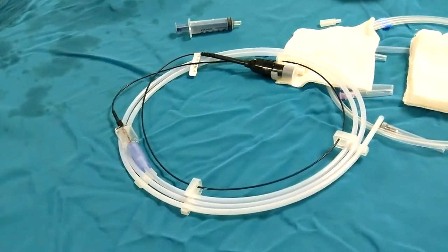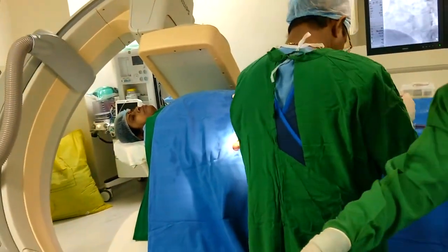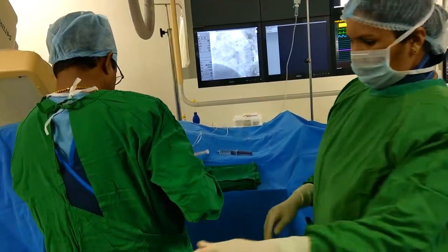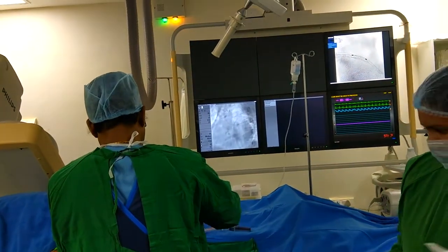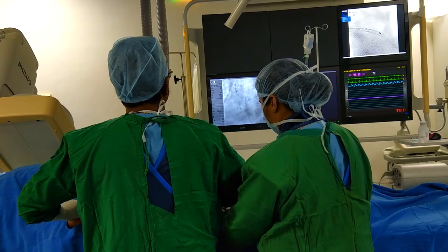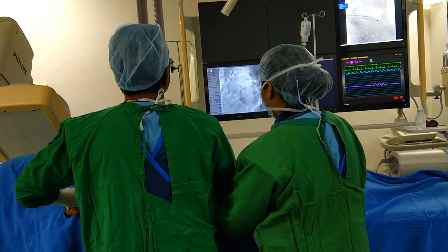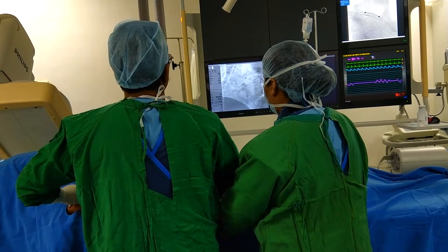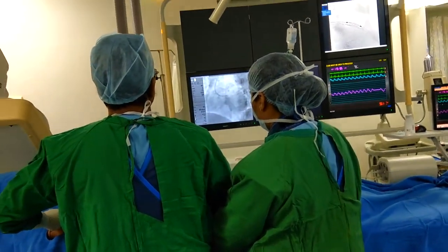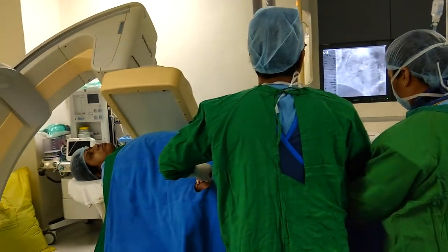The lesion appeared different in different angles and dimensions. To decide whether to put a stent or not, we are using intravascular ultrasound for this patient — to identify and visualize the plaque volume. This gives the best result and we can take the decision effectively to treat the patient.